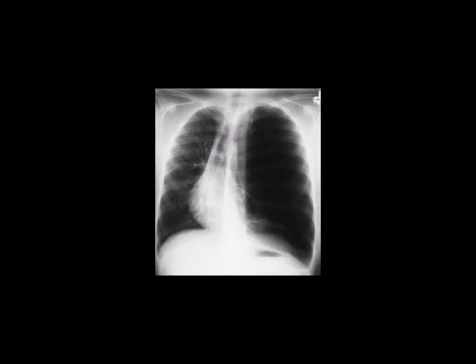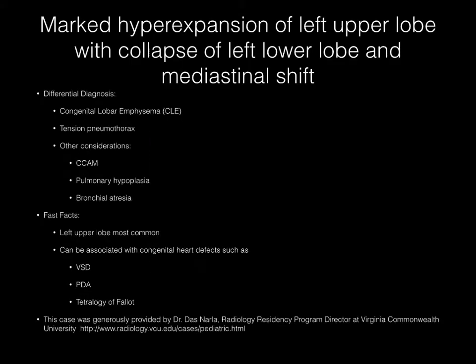Now pause your media player. This frontal radiograph demonstrates marked hyperexpansion of the left upper lobe with collapse of the left lower lobe and mediastinal shift to the right. Your differential diagnosis should include primarily congenital lobar emphysema, or CLE, and tension pneumothorax. Other considerations could also include C-CAM, pulmonary hypoplasia, and bronchial atresia.